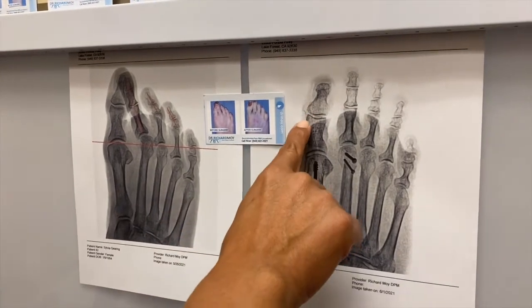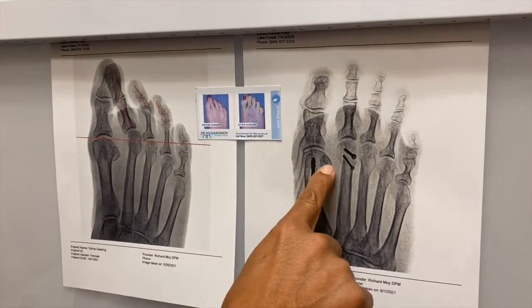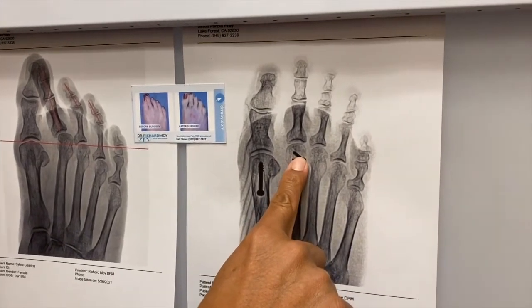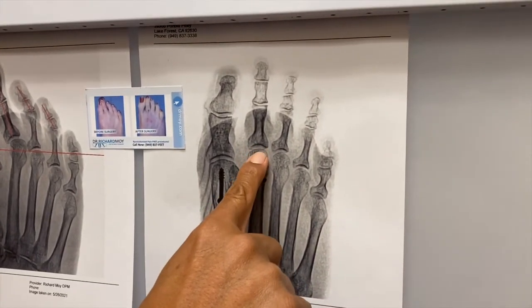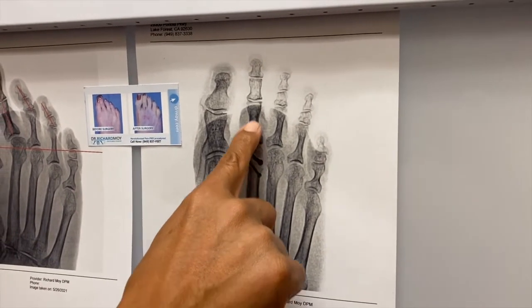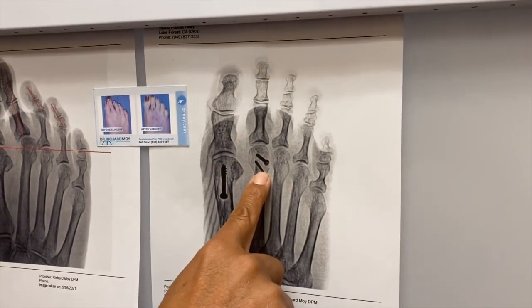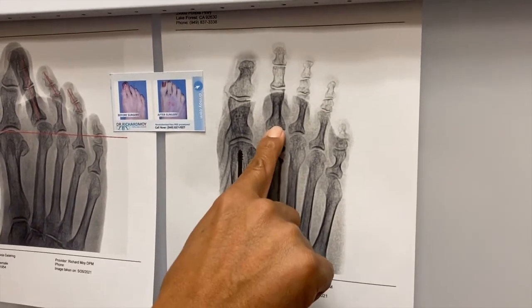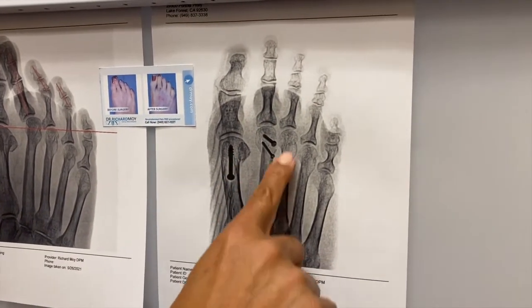This is what it looked like before, and this is what it looks like after. The bunion is gone, the toes have been realigned. We shifted this bone so it's slightly shorter and more to the left, and that allowed us to realign the second toe directly over the longitudinal bisection of the second metatarsal, as well as the third toe on the third metatarsal.